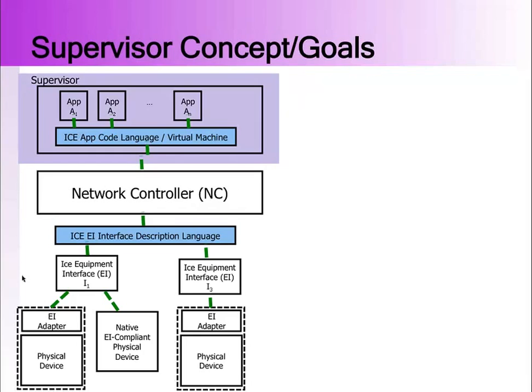So the first component you see is the application hosting component. And if you're familiar with the concept of a separation kernel, it either appears in the MILS security work or, for example, in the context of flight software like the operating system that runs on the F-35 strike fighter, it includes a separation kernel. And it includes strong space and time partitioning of the apps that are running.